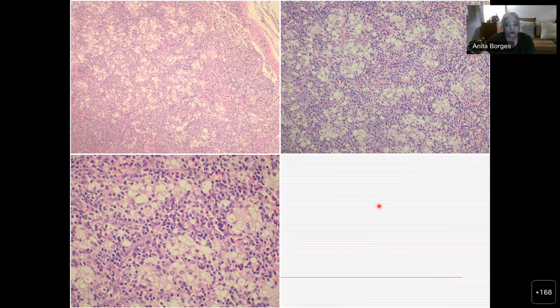But what I want you to see, even in the H&E, is what is in the cytoplasm of these histiocytes? You can see that there is a kind of grayish conglomerate of some sort. So you have to investigate this. This is not Rosai-Dorfman disease, because you don't see emperipolesis. So whoever said Rosai-Dorfman disease was just reacting. There is no emperipolesis on the high power.